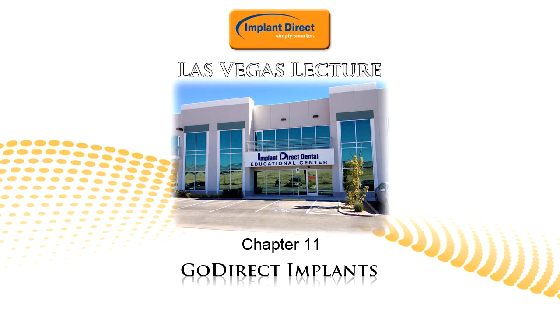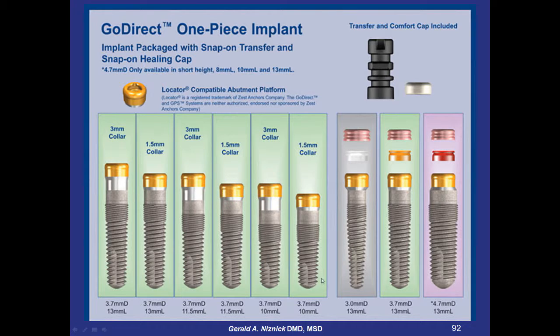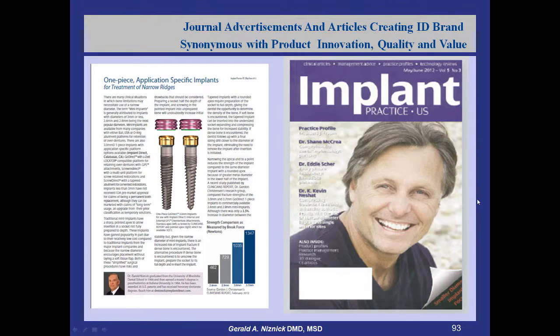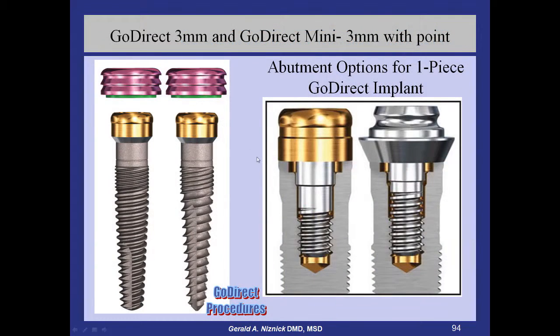We now have the GoDirect with a pointed end. The GoDirect first came out with a round end in a 3, 3.7, and 4.7 diameter implant. Here was an article that I had published talking about the new mini GoDirect with the pointed end. And this implant has internal threads, so it can take a variety of other abutments. I'm going to show you a video now that goes through these procedures in great depth.